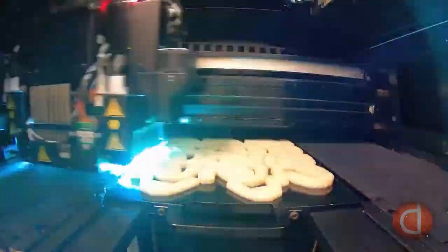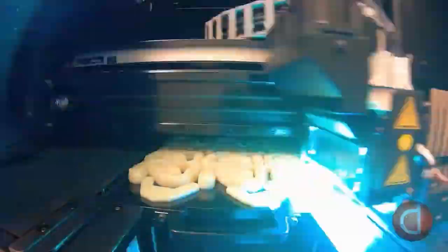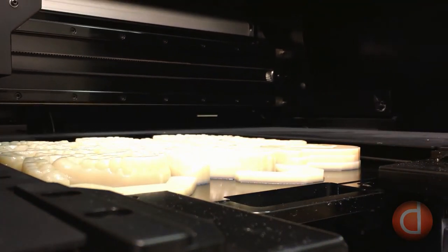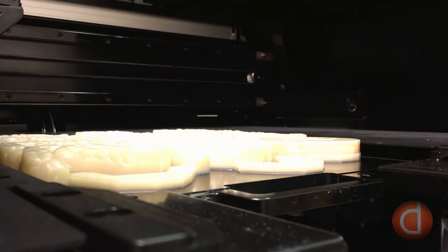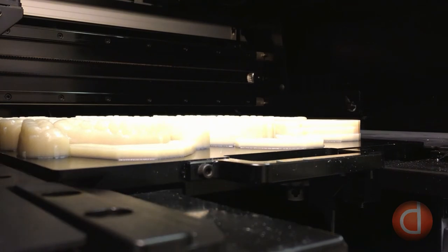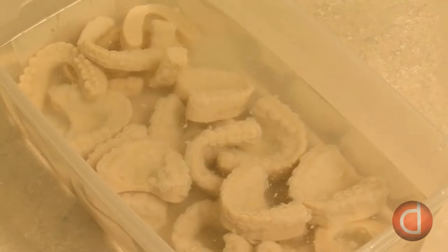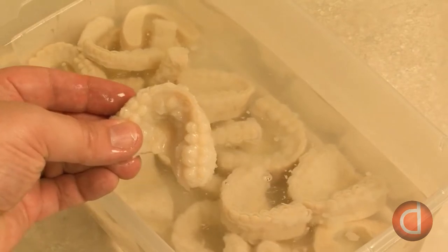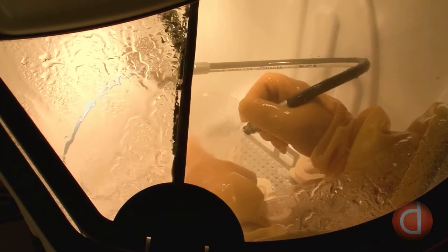A 3D printer builds dental models by stacking approximately 750 layers of material. This process takes about four and a half hours because each layer is about one-third of the thickness of a sheet of copy paper. The printer uses two materials: a resin which makes up the physical model, and a support material which keeps the model from shifting during printing and provides structural support. The support material is water soluble, so once the models are printed they are soaked in water for 10 minutes and the support material is removed using a special pressure washer.